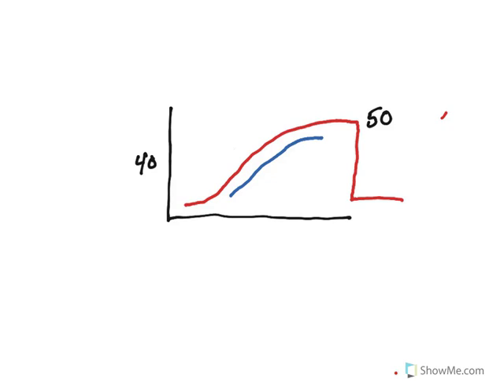This patient is having a bronchospasm, and you all know this. You've been taught this before. You've been taught what to look for on this end-tidal CO2, and we call it shark fin. Now, this is a really nice, straightforwardly defined shark fin. You can look at this and say, yeah, that looks just like a shark fin.